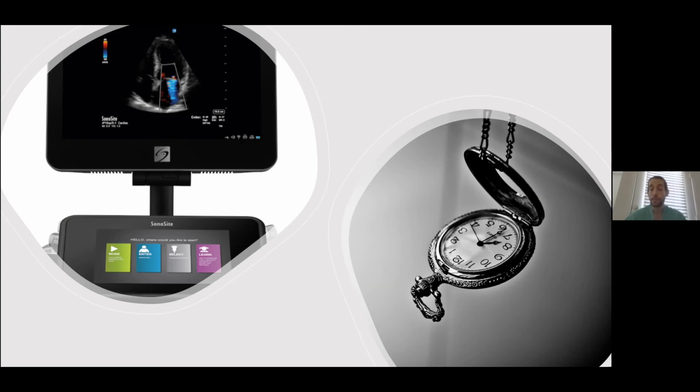The other thing is that you're going to need some time. These are very long clips. You're going to do 3 different phases, just like they talk about in CT scanning with contrast: an arterial phase, a venous phase, and then possibly a washout phase, not necessarily relevant to trauma. You're going to want to change your clip settings from 6 seconds, which is what most of us have them set on now, to about a minute. Depending on the organ you're looking at, it can be anywhere from 1 to 3 minutes to get to the arterial and then venous phase. The washout phase you'll start to see typically 4 to 6 minutes in.